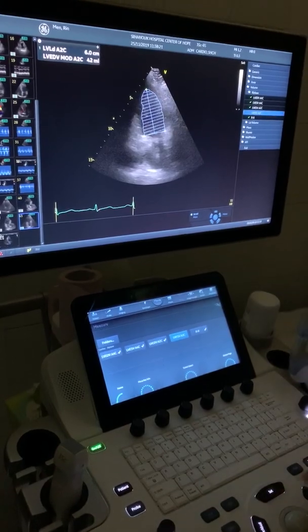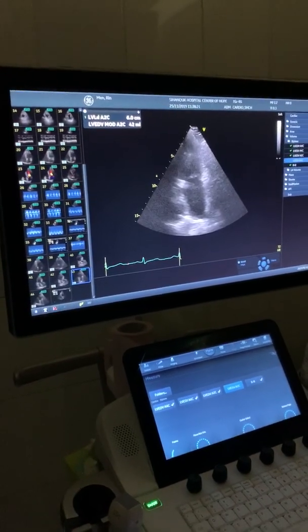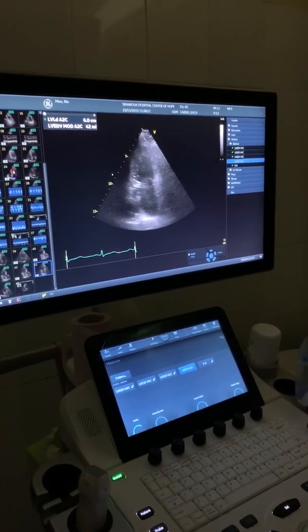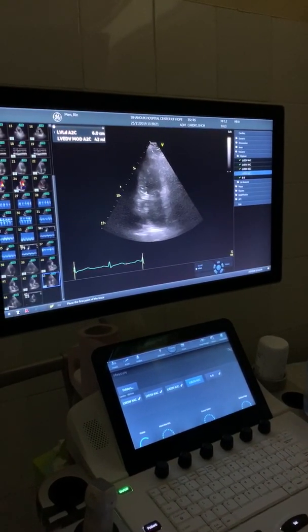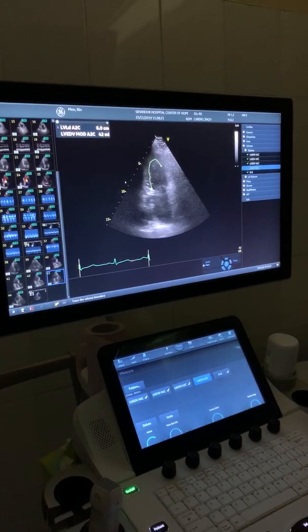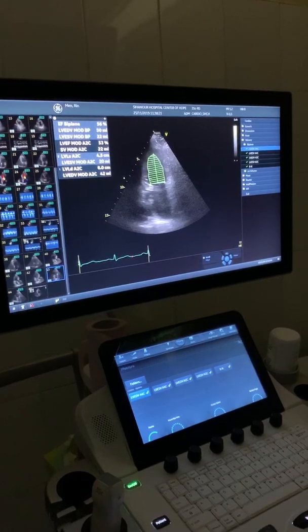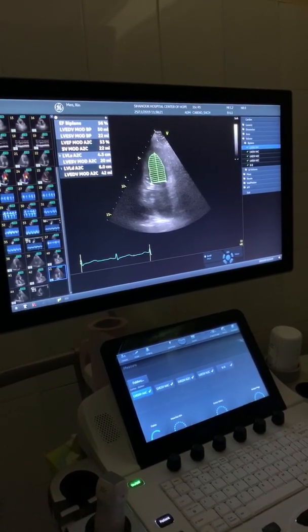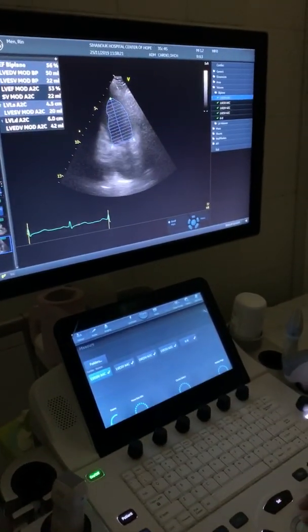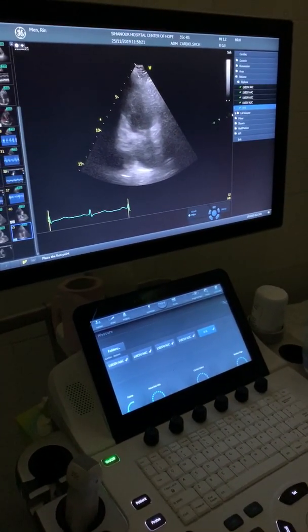Okay. Then my systole. I scroll. Small. Okay, that's small. Okay. You can see. Here. Where's my cardiac output? You did not. Maybe you need to go back here. Strange, but it's supposed to give me my cardiac output.